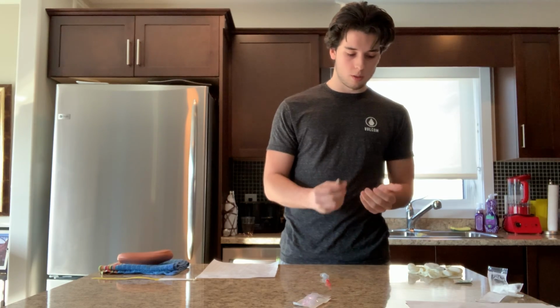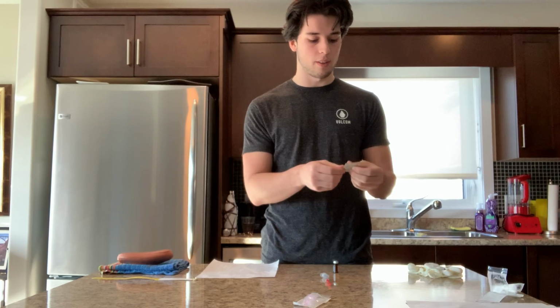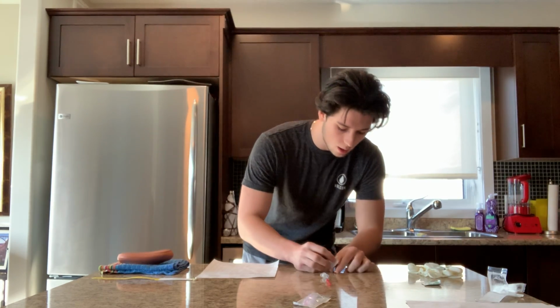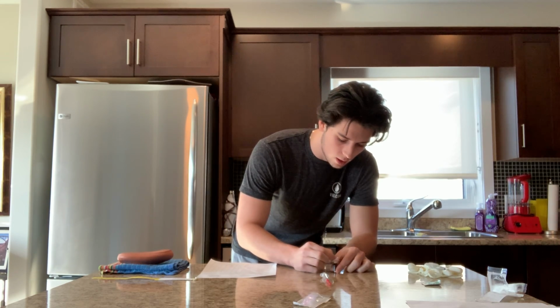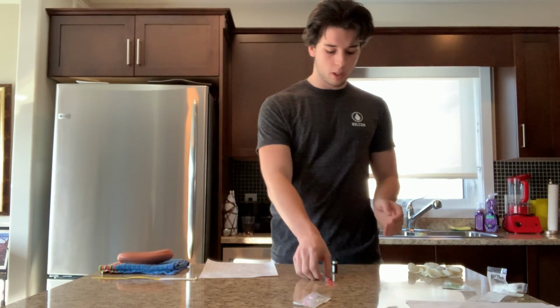So I'm going to check it's also not expired. And it's the right medication of metoclopramide, and I'm going to grab an alcohol swab. And we are going to swab the top of this vial, cleaning it for about 30 seconds. We're going to be swabbing it. So, right, we're going to say that that's been 30 seconds that we've been swabbing it. So now we can just throw that in the garbage, and now we are ready to inject.